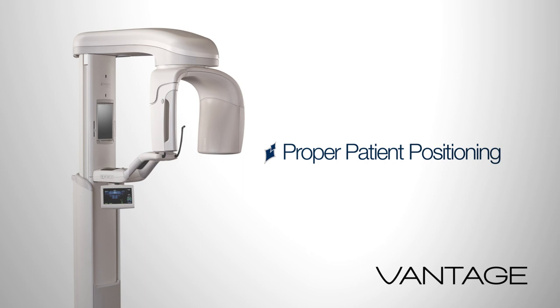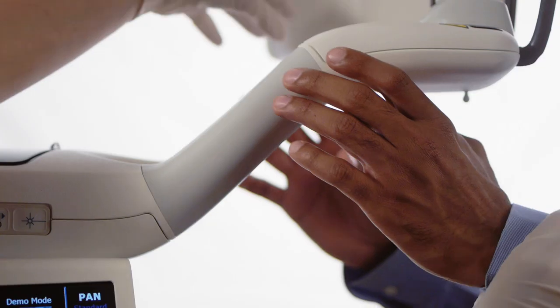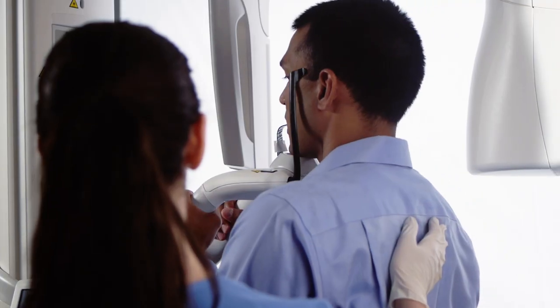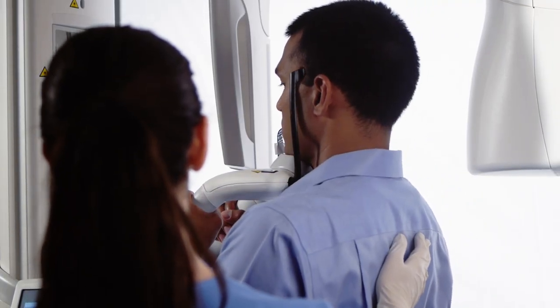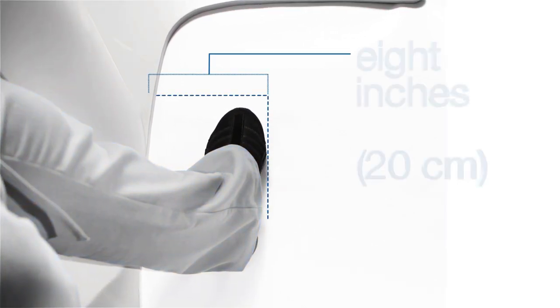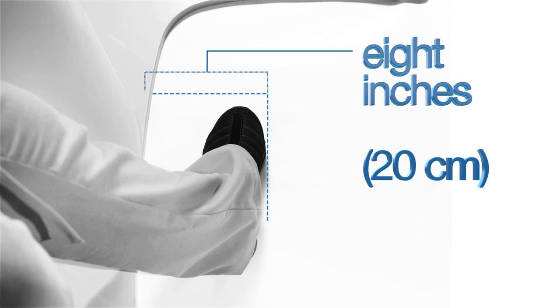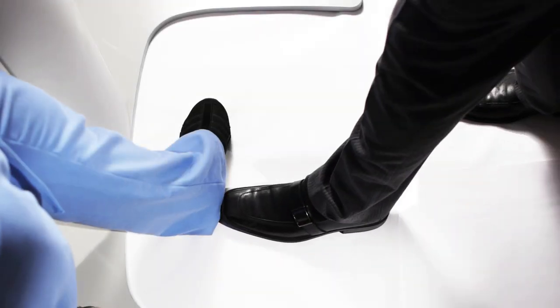Begin patient positioning. Instruct the patient to place their hands on the stabilizing grips. Gently guide the patient towards the vertical column. Instruct the patient to bring the toes in contact with your instep, which will be placed approximately 8 inches in front of the vertical column.